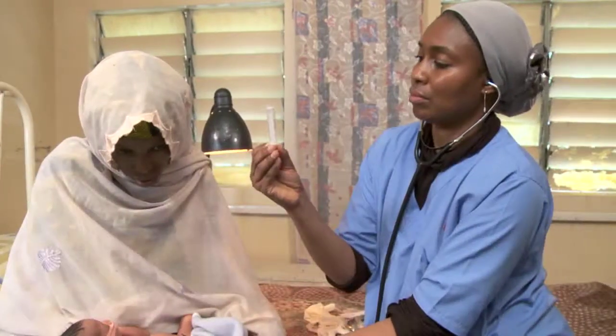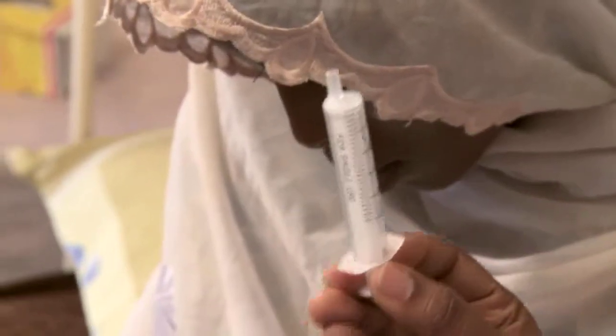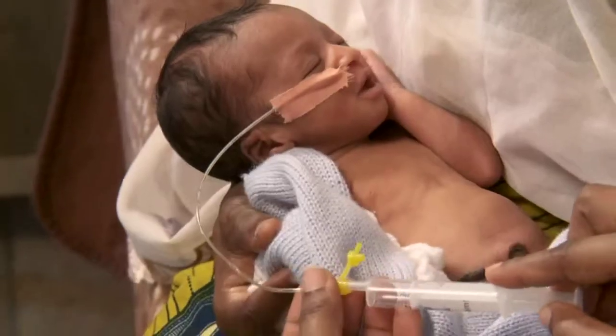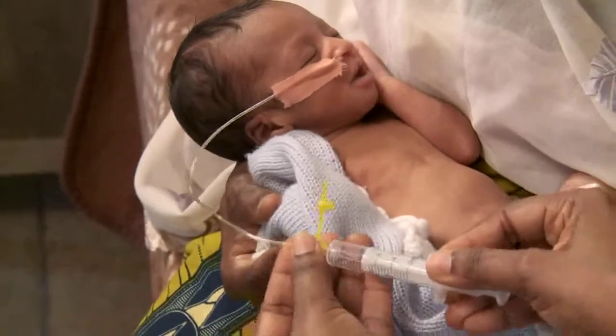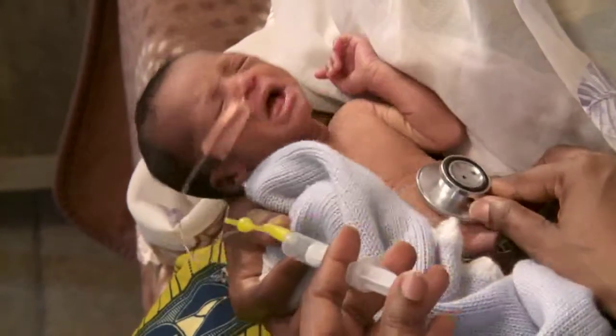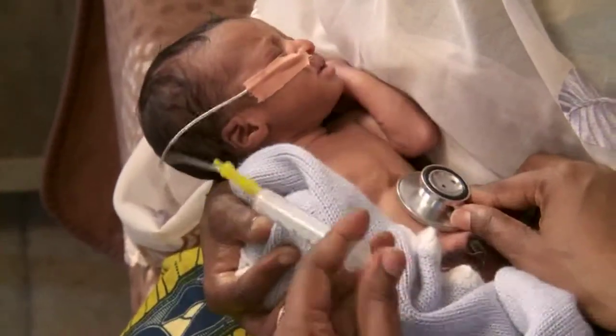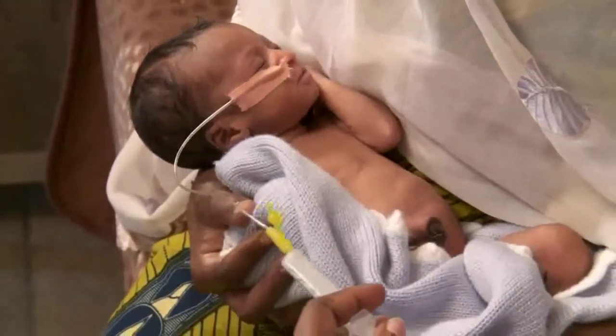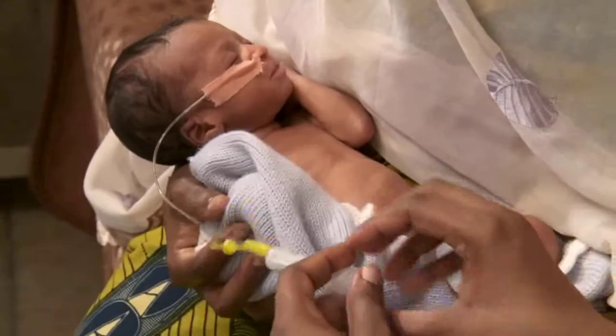Always check for correct placement. Here's how. Fill a syringe with 2 milliliters of air. Connect it to the tube. Inject the air quickly while you listen over the stomach. A whooshing sound tells you that the air has entered the stomach. If not, remove the tube and repeat the procedure.